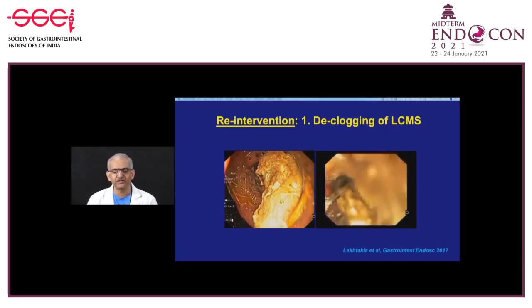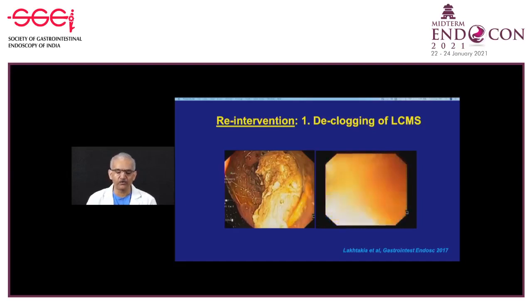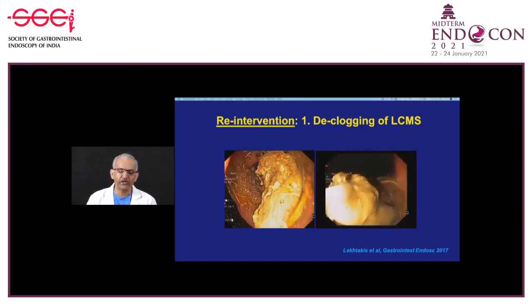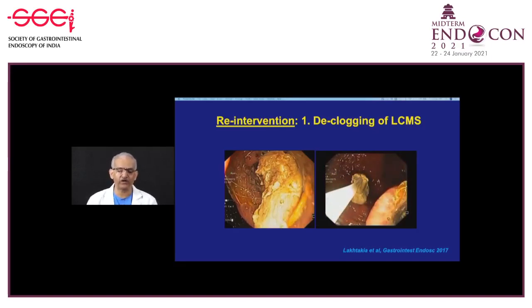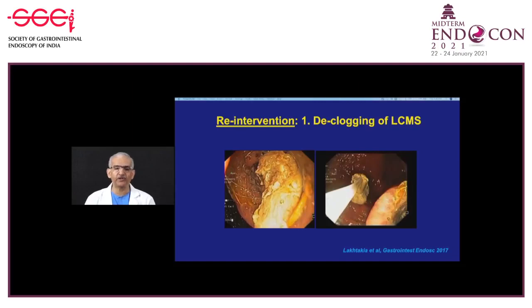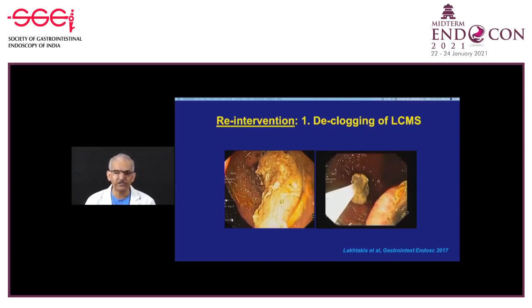The snare holds and catches loose debris well and takes it out, unblocking the stent so all fluid can drain out. There can be more debris inside that can re-block. After removing clogged debris, you can quickly inspect inside to see the cyst cavity—whether granulation tissue is present, or if more loose debris is there—and remove them at the same procedure.